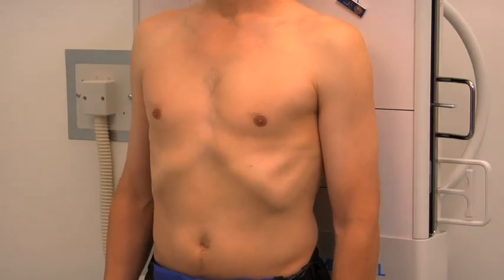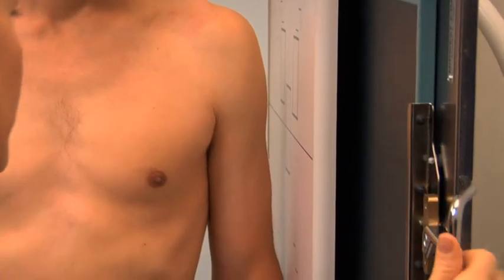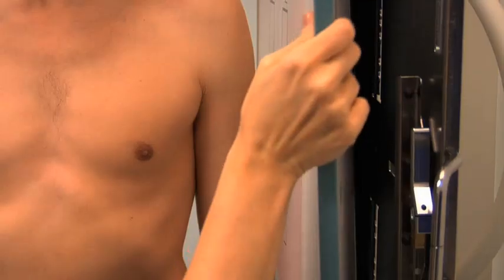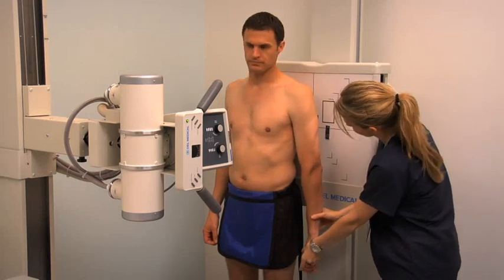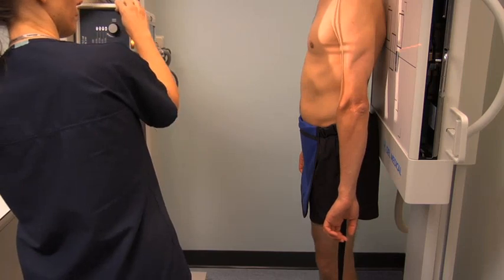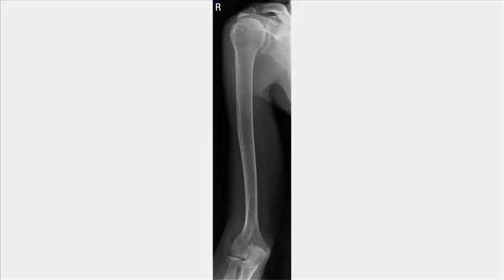Once the exposure is completed, inform the patient that they may relax and breathe normally. Process the cassette while preparing for the next projection. To obtain a lateral projection of the humerus, place another 14-by-17-inch cassette lengthwise in the upright bucky. Pronate the patient's hand and internally rotate their arm. Align the central ray to the midpoint of the humerus, collimate as for the AP projection, and expose the cassette. Review the images for both projections.